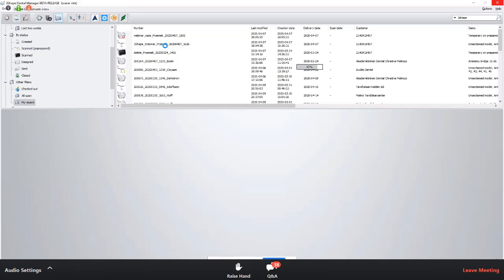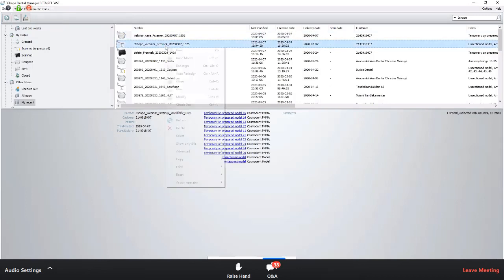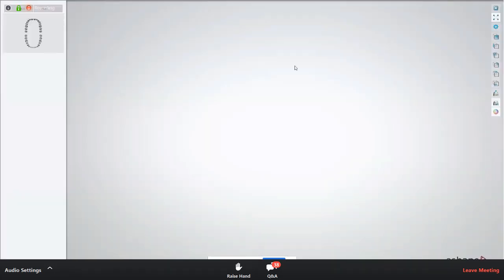Yeah, and I just got the latest beta today. I think I installed it like 30 minutes before this webinar, so maybe I'm crazy, I don't know. I know that Kate says, I'm not sure if you're brave or crazy, but well, as you can see, it's actually today's date probably, or maybe yesterday's, I'm not sure. I can open it up and see.